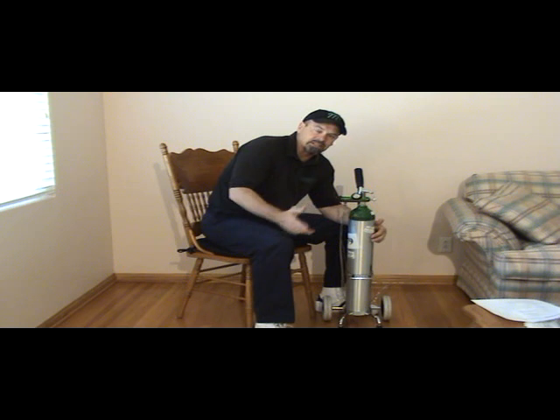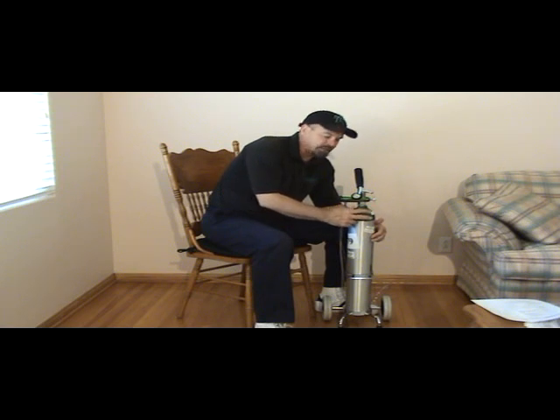So position it in a place that's out of the way, but in an area that is open, that's not closed. Never in a closet, never under bedding or any place like that. If the oxygen would escape from this and would go into bedding or something like that, it could saturate that area, and then a spark could cause it to become a huge problem. So we want to make sure that we get plenty of airflow around it. So please keep it in an area that's safe, that will keep it from getting knocked over.